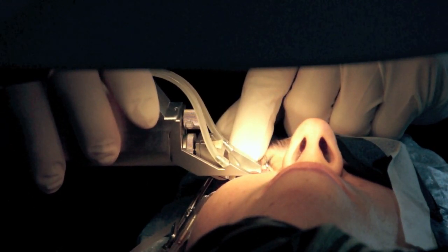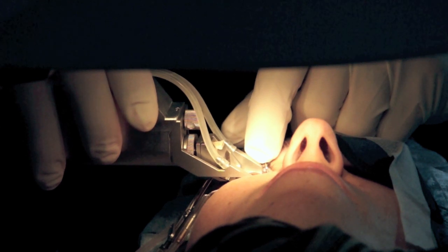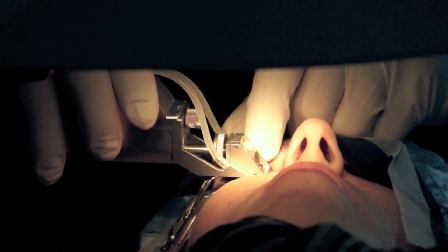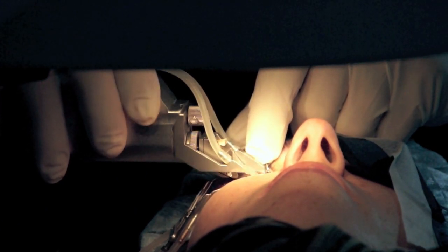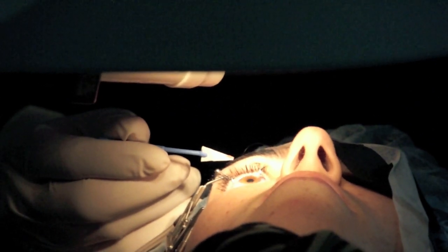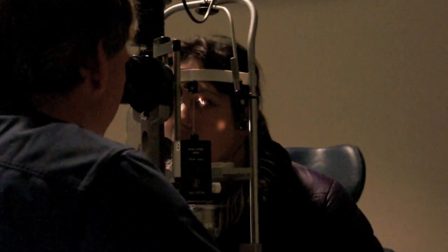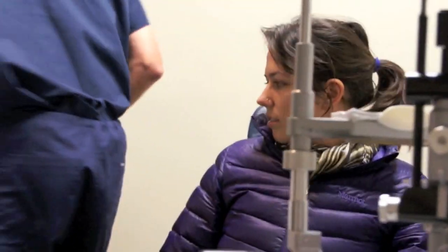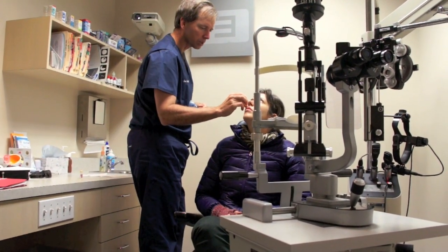Good job. Very good. No pressure. Good job. It looks quite good. So it's just important to rest tonight, and you want to keep your eyes really moist. Putting these moisture drops in even every half hour is a good idea. So I'll put some in right now. When you put them in, you can just pull the lower lid down and drop them above. Try to get at least maybe three sets of the antibiotic and steroid.